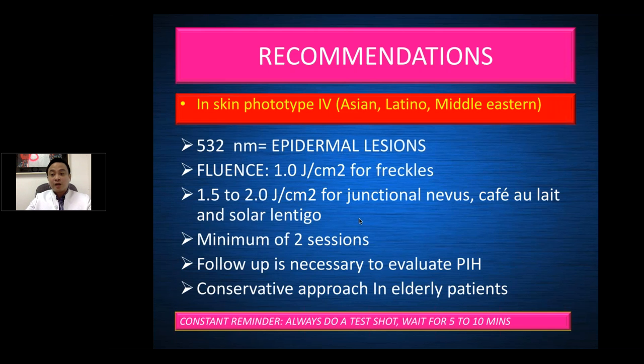And a constant reminder to all those practitioners who use the Nd:YAG or the pigment lasers: we should always do a test shot because we cannot predict what will happen next. If we do a test shot, we wait for 5 to 10 minutes, and if there is no untoward reaction, such as blistering or severe erythema, then we can continue the procedure.